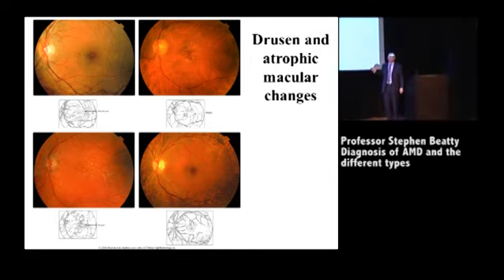These are some drusen, very subtle in this case. You could barely see them. These are more obvious drusen. Drusen is just a word for white dots at your macula. There's some more obvious drusen. Here, we have even more obvious drusen, and sometimes you can get drusen outside of the macula. And if you can't see it on this photo, but on slit lamp, this patient does have one drusen right at the center. So again, a lot of people get confused by this.